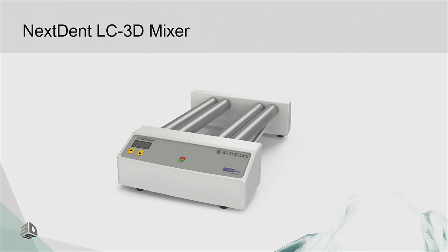And one of the first important aspects here is mixing. You want to mix the materials before you print them. Why? We use some opaque materials, and these opaque materials, these pigments in that material, will tend to sag a little bit throughout time. So if you have some stock and the bottle is sitting there for like 2 months, you need to mix it first in order to get a perfect print job. You can do that by hand, but trust me, it's much easier to get the LC-3D mixer. It's a small, affordable device which makes your life a lot easier. So you've mixed the material, now you're ready to print.